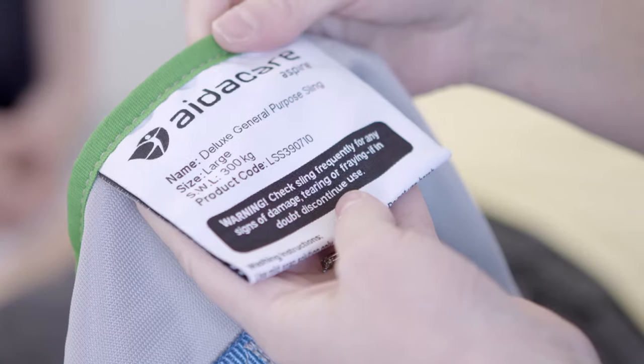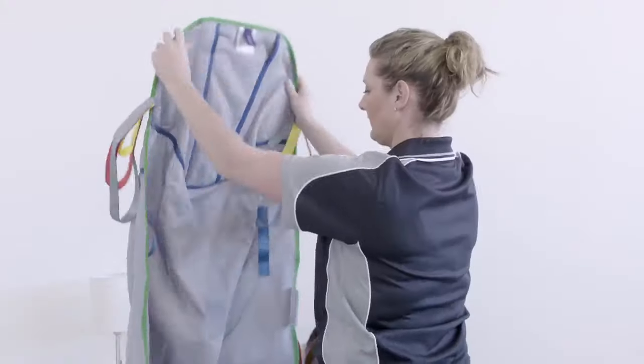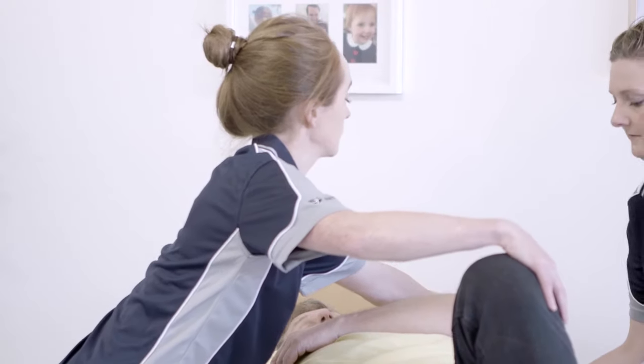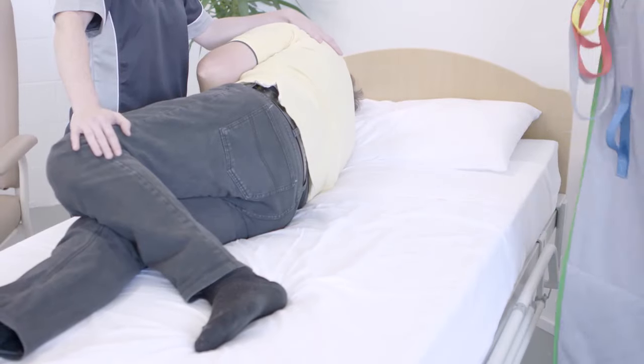Before applying, check that straps and labelling are visible on the outside of the sling. Then fold the sling lengthways to allow you to position it. Assist the resident to roll onto their side. Remember, do not lean or bend when doing this.